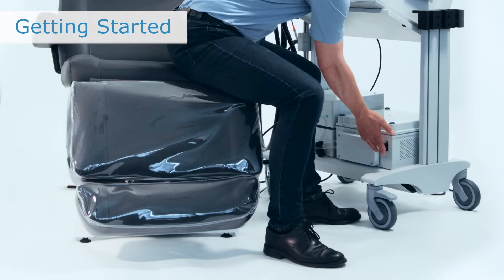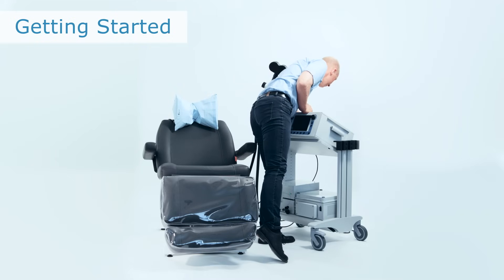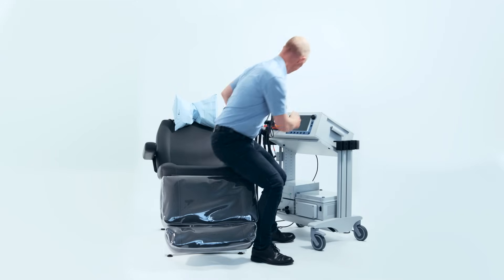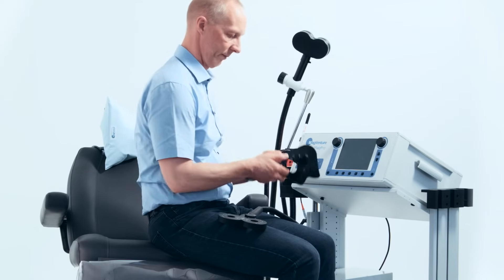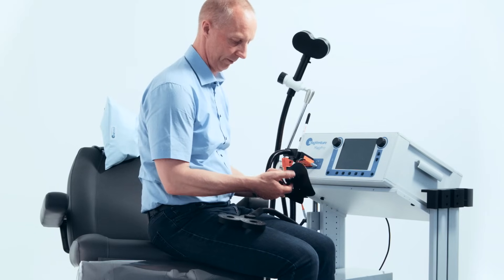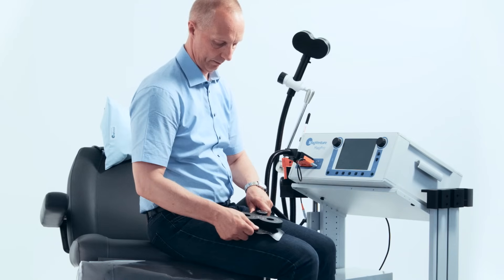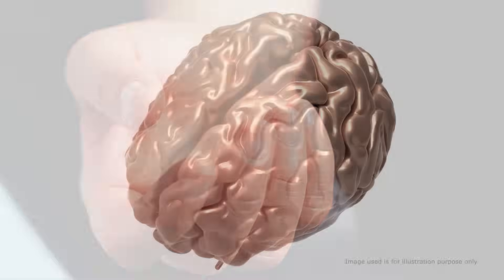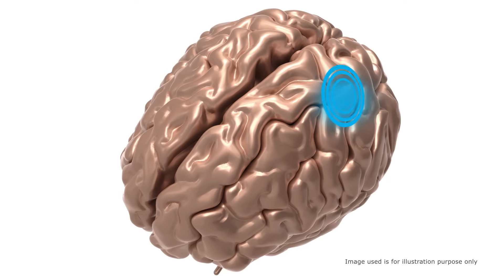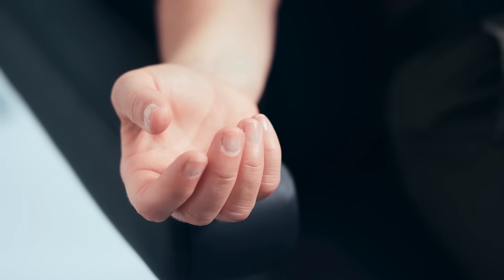Before initiation of any TMS treatment, the correct stimulation intensity for the procedure needs to be established. The stimulation intensity of the therapeutic procedure is based on each patient's individual sensitivity, also known as the patient's motor threshold. With the MagVida TMS therapy system, the MT is measured by observance of a visible muscle twitch of the right thumb after stimulation of the motor hotspot for the intrinsic hand muscles in the motor area on the left hemisphere in 5 out of 10 stimulations. The lowest possible stimulation intensity needed to get a visible twitch of the thumb represents the patient's motor threshold value.